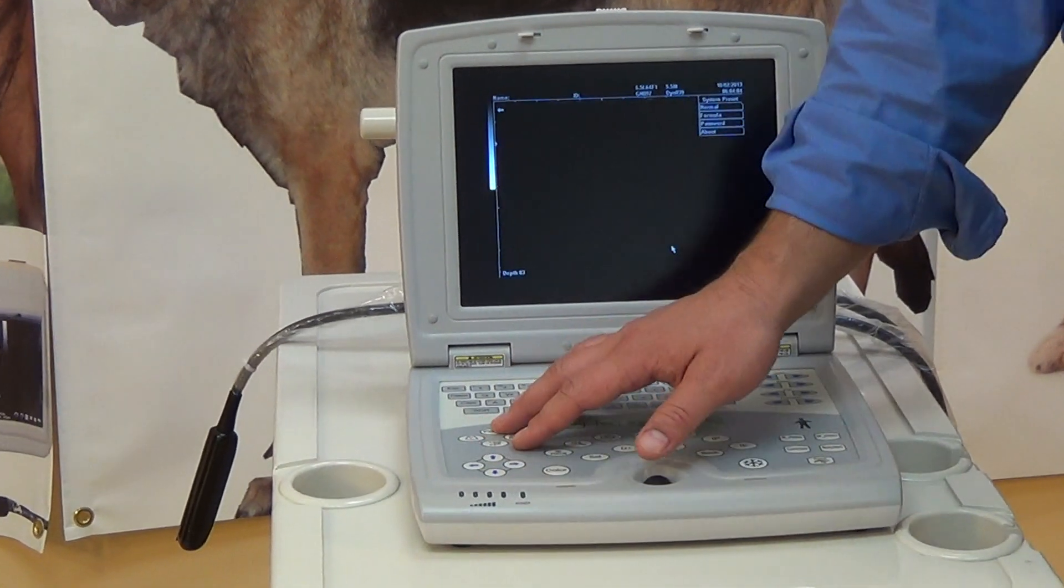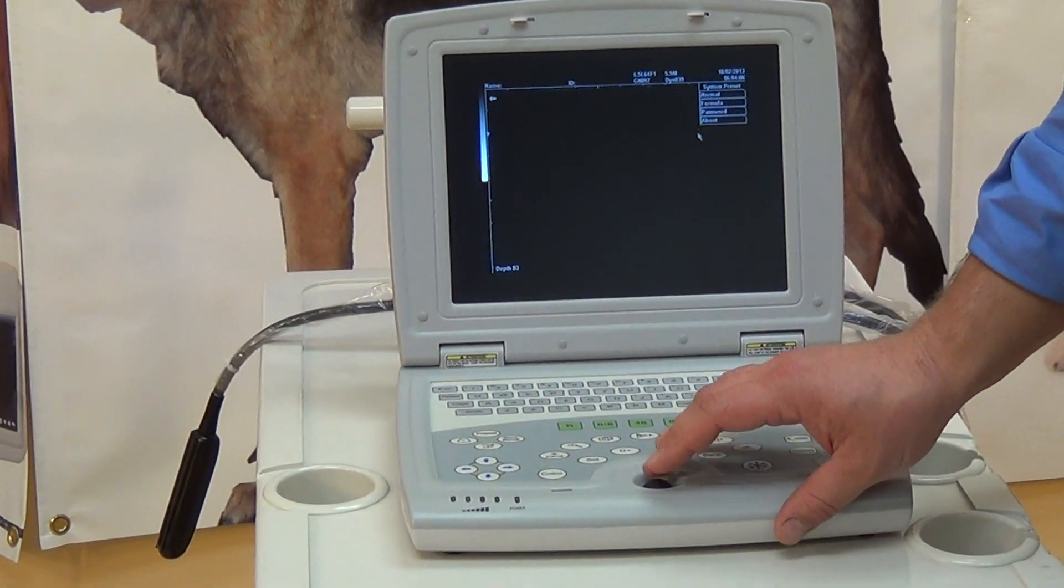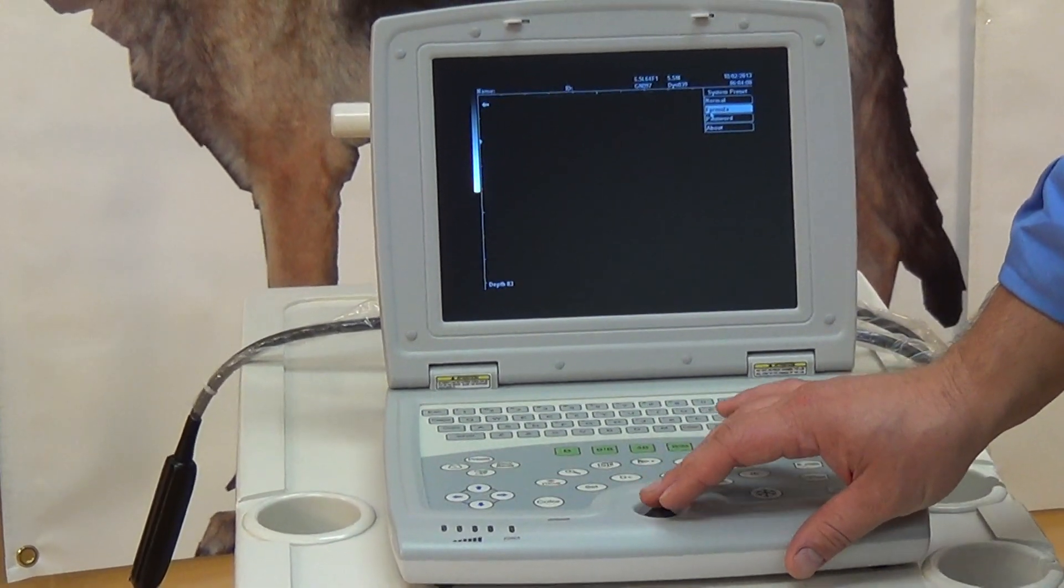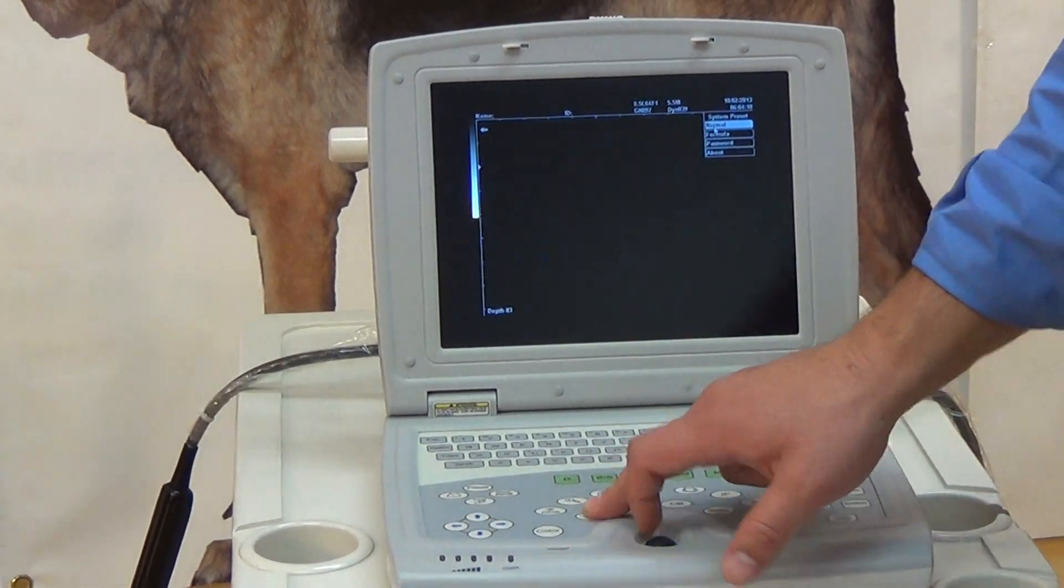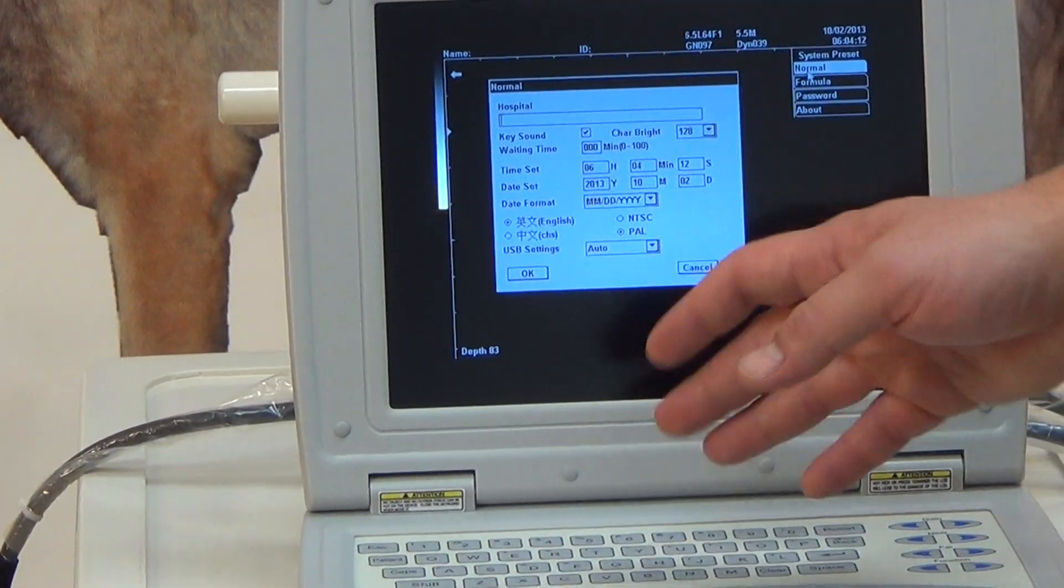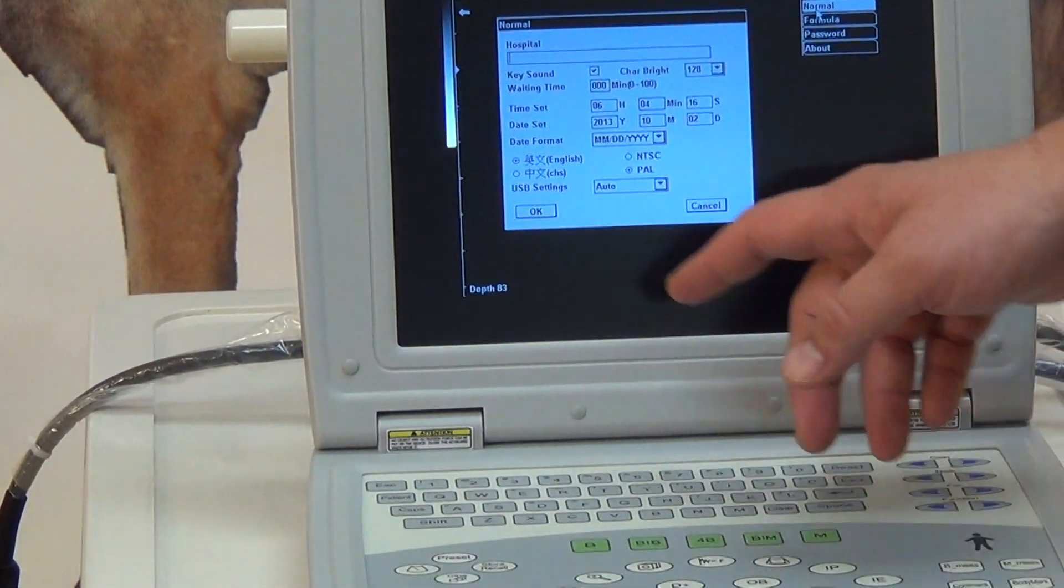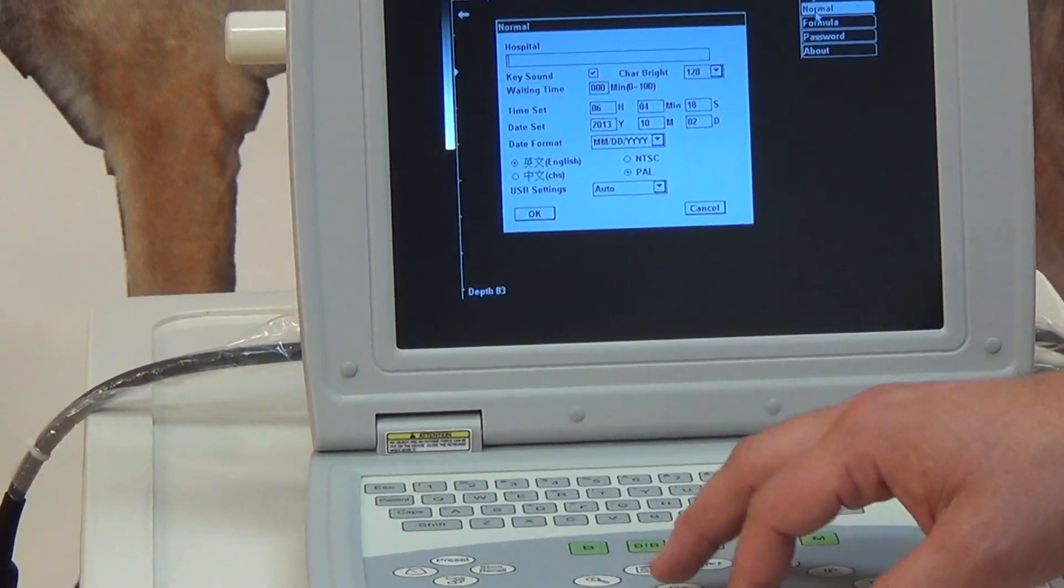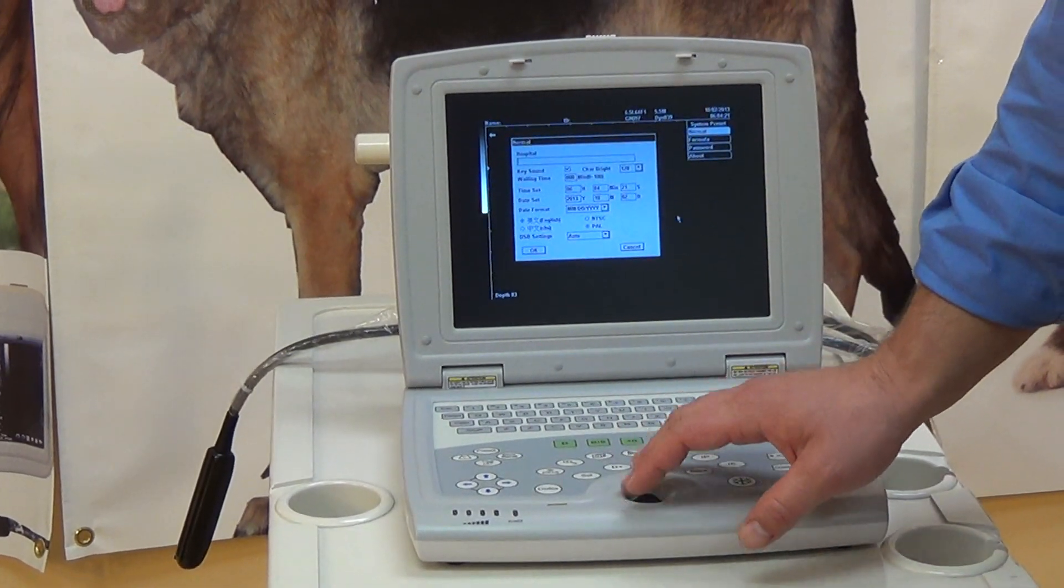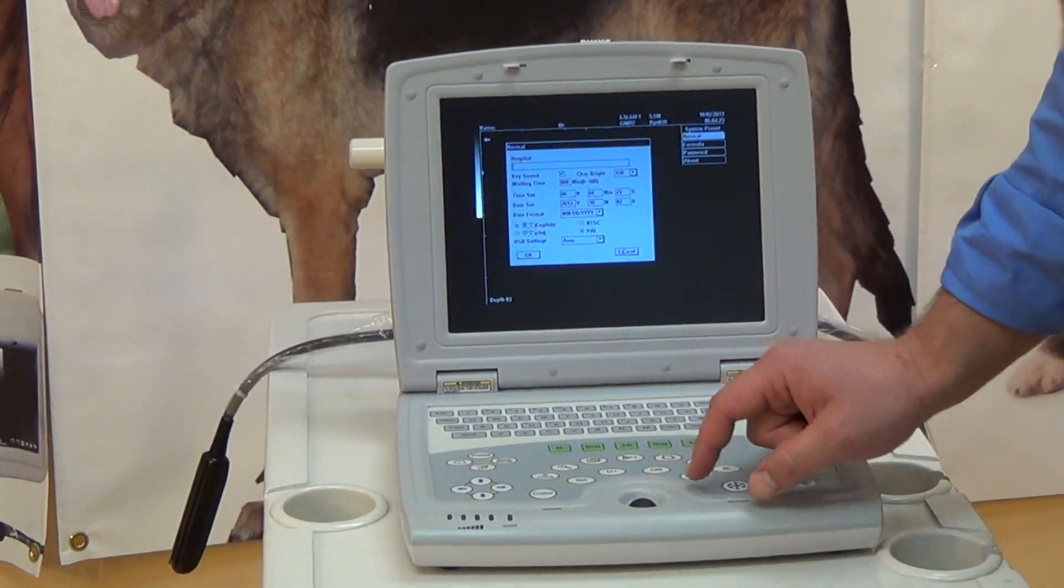So we'll start out with the preset button. This allows you to change things like your formulas for OB settings. If you select the normal part, you could put in like hospital name, change the date and time, language settings, and how you save via USB. Usually we set it to auto so it automatically goes straight to your USB. That's what most people prefer for saving images.